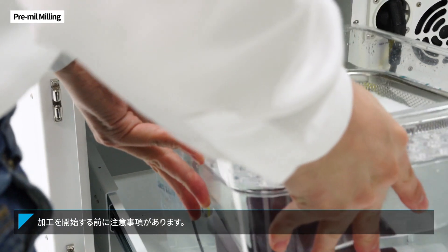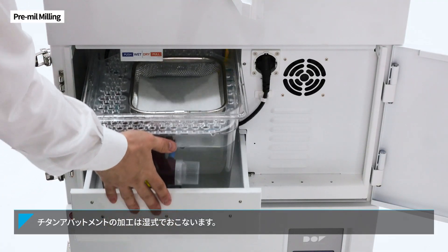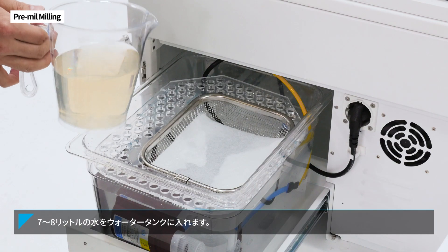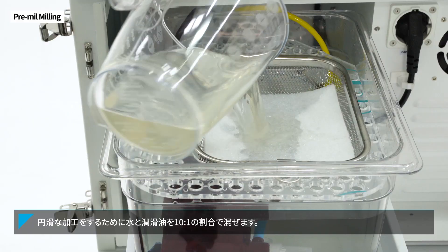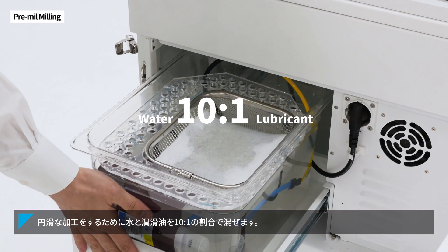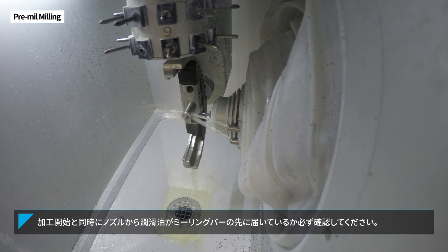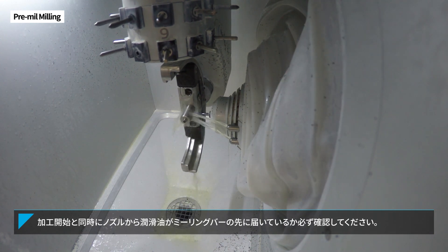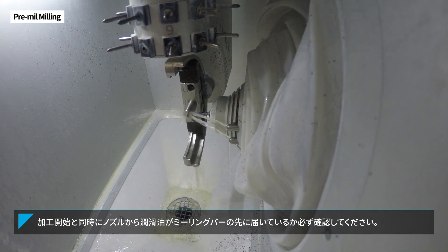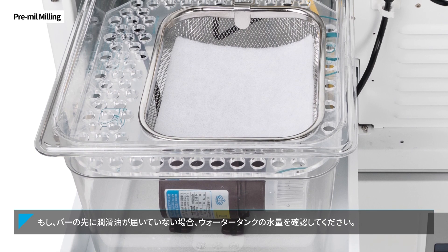Now you can start milling, but there are a few things you must keep in mind. Before pre-mill milling, fill the water tank with 7-8 liters beforehand. For stable milling, mix the lubricant with water at a ratio of 10 to 1. Pre-mill milling must be processed in a wet setting. As soon as you start, check that the lubricant on the nozzle is touching the tip of the tool. If the lubricant does not reach the tip of the tool, check the water tank volume.